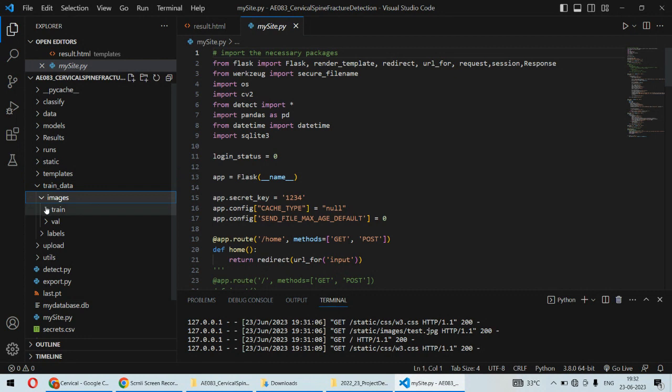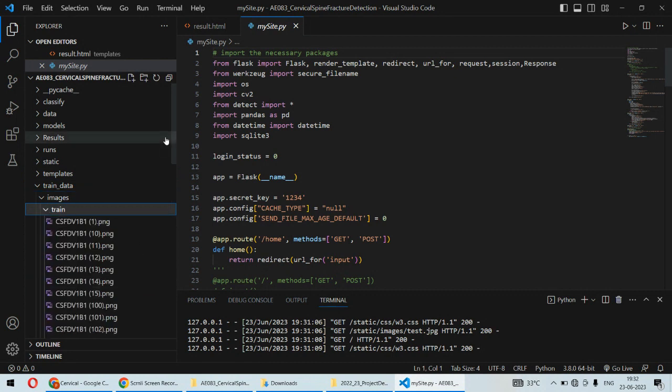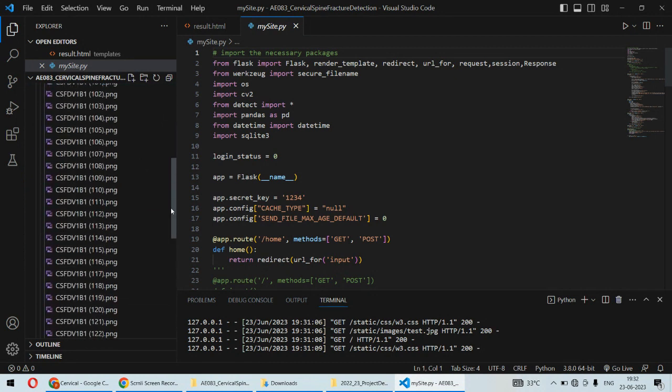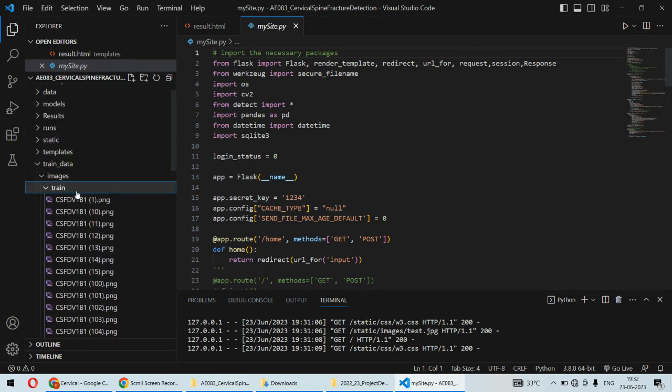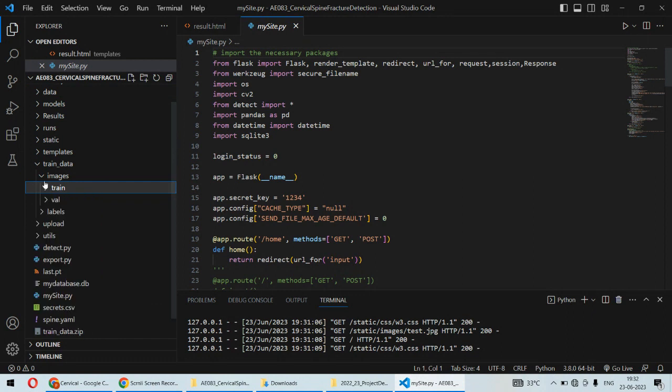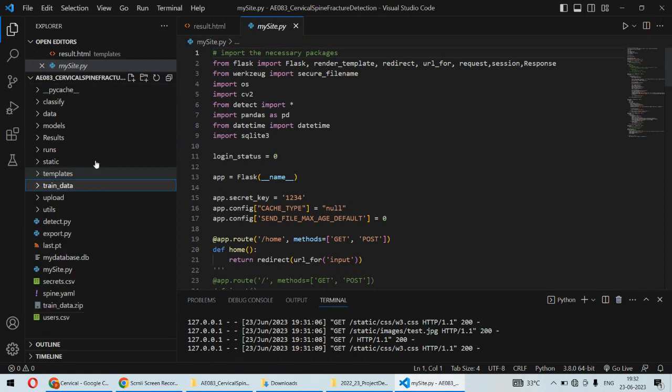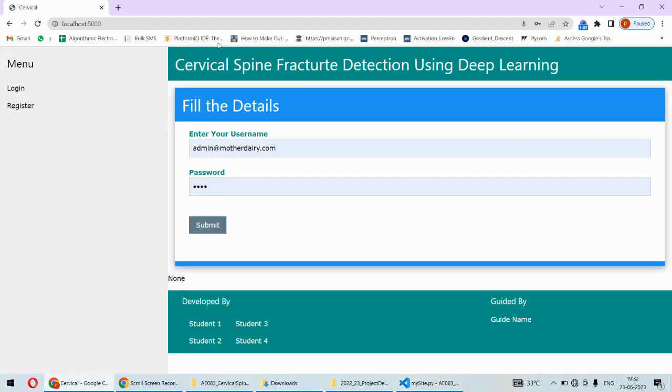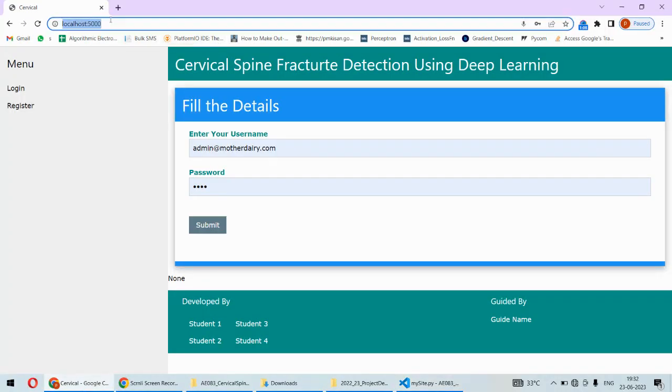Once the model is trained, then we can actually classify or we can detect the fracture regions. It will correctly identify the fracture regions in that particular spinal image. So that is the idea behind this project.